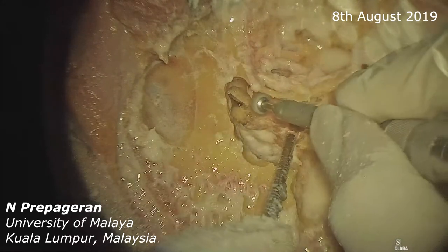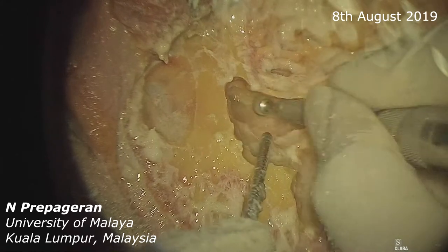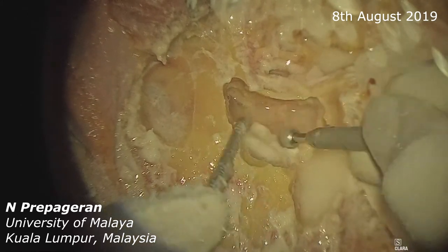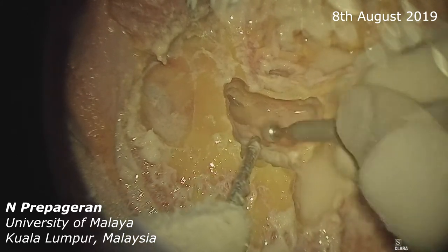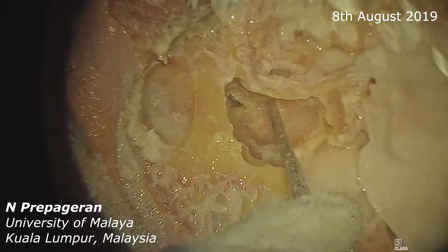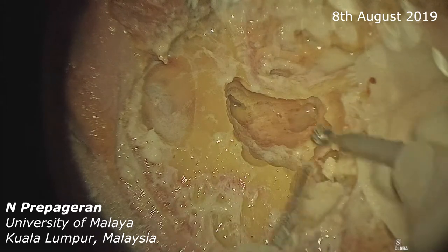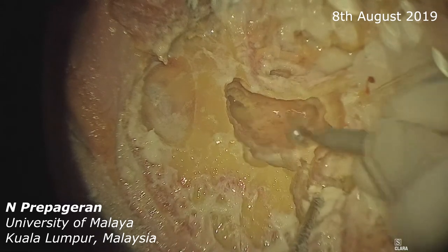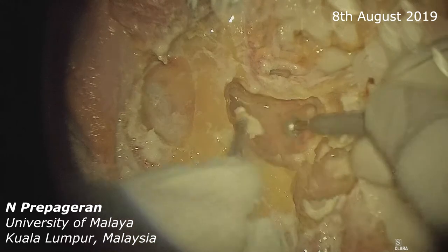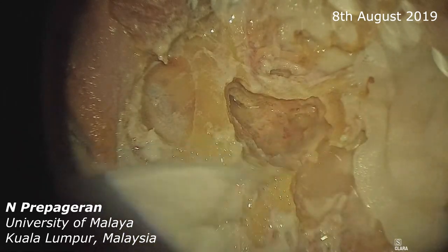So now we're going to drill and thin the ear canal wall. We've already found the incus and the lateral semicircular canal. So now let's look for the sigmoid sinus and the other structures as well. There's a lot of air cells here, as you can see.